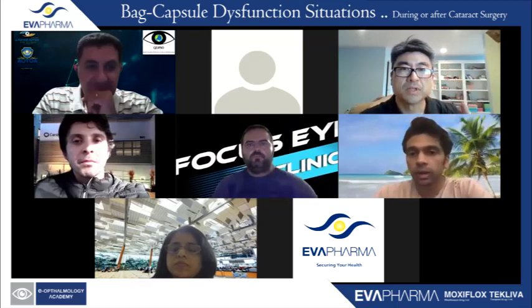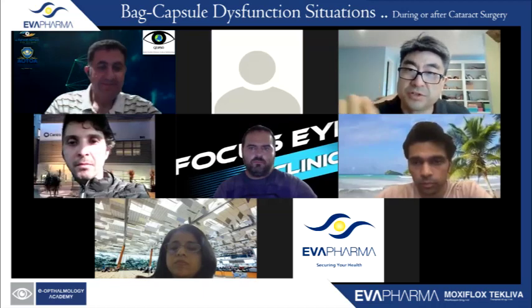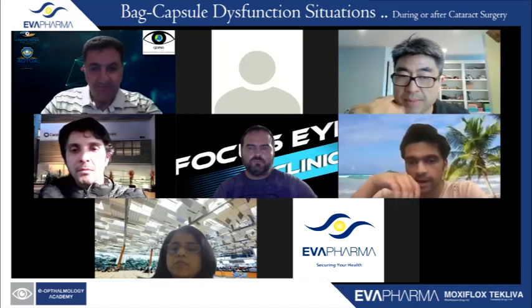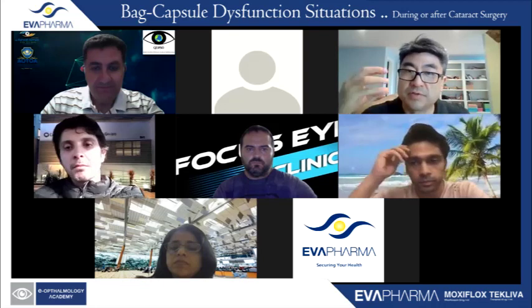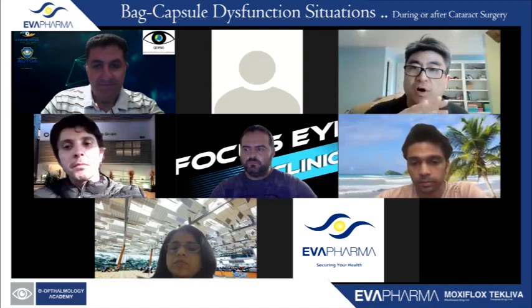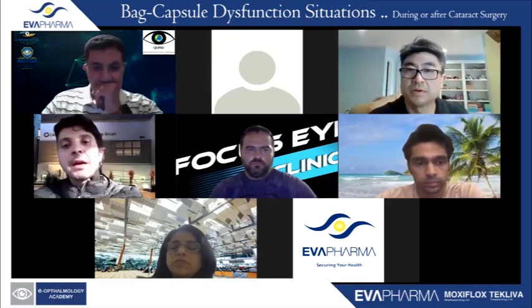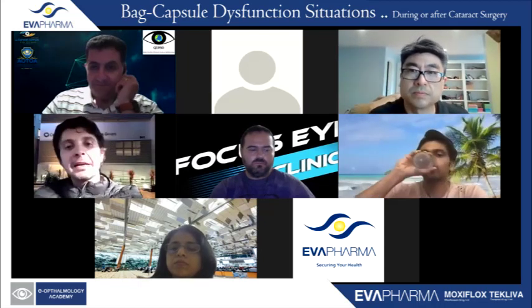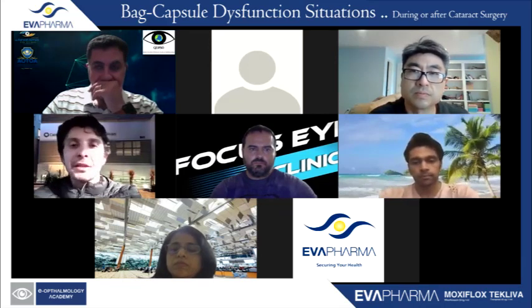Brian, last comment, and then we'll move on. Sergio, one last comment. With the 5-0 Prolene, I've tried to do your technique to lasso a CTR, I mean, a 3-piece IOL, which worked okay, but it's very stiff. It's very rigid. Is there a reason why you haven't transitioned all of them to 6-0? Yes, this is the reason. I did this modification for when you have a loop in an acrylic IOL, because with 5-0 this kind of fixation is difficult. It's rigid.